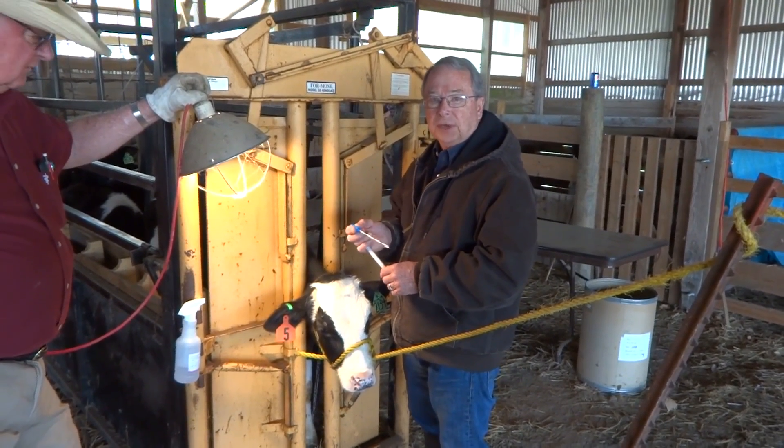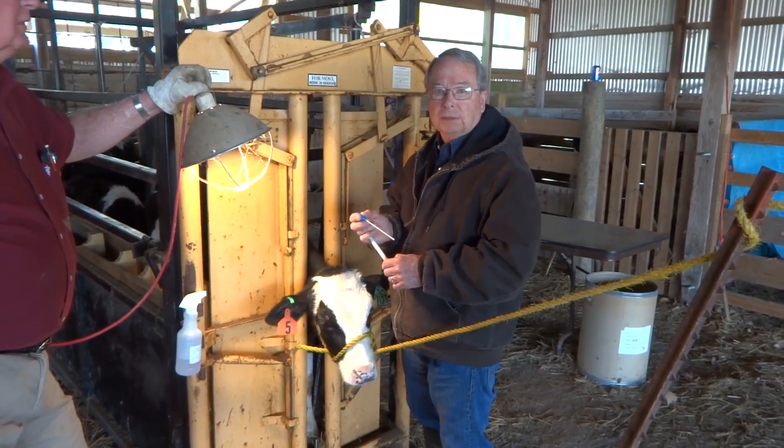Today I'd like to show you how we culture calves' eyes for Moraxella bovis and Moraxella bovaculi.